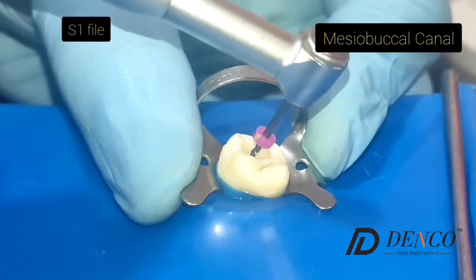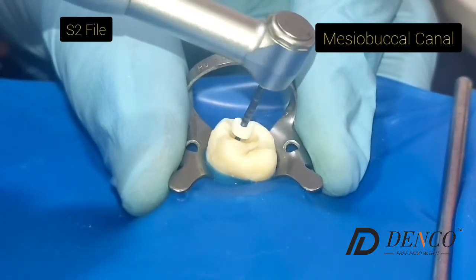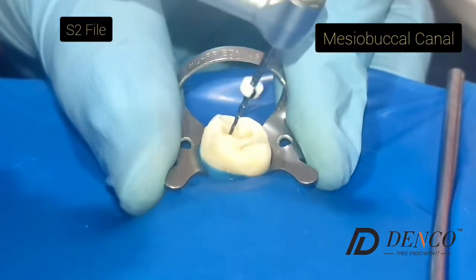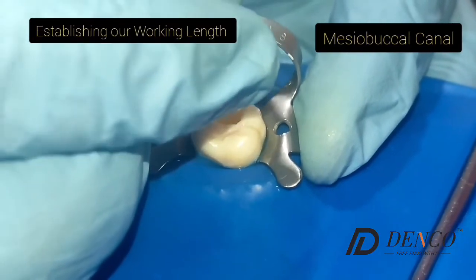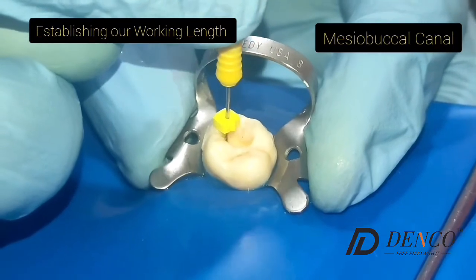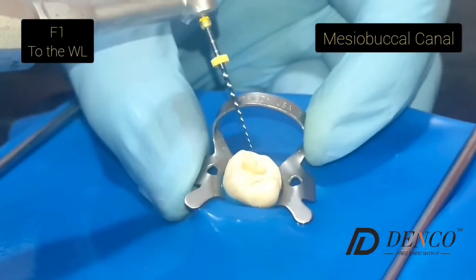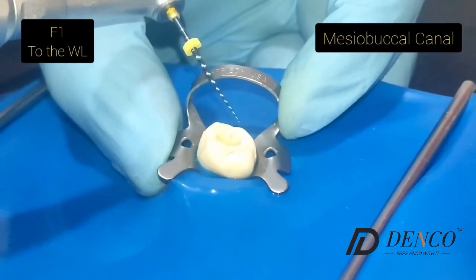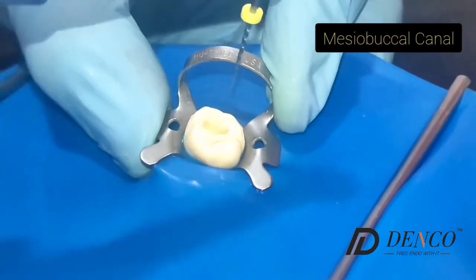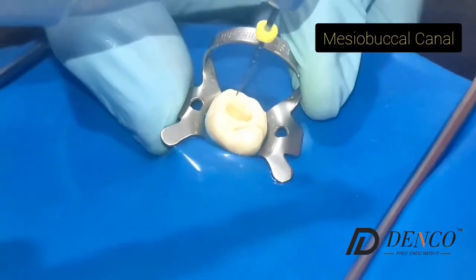Coronal and middle third of the canal up until the available length. Then we use the S2 file — shaping two — up until the available length to prepare the coronal and middle part of the canal. After using the S1 and S2, we measure our working length with a radiograph or electronic apex locator — in this case we use a radiograph. After establishing our working length, we use the finishing file F1 — finishing one — to finish the apical third of the mesiobuccal canal, using one, two, and three light apical pressure movements to reach the apex and prepare the canal.